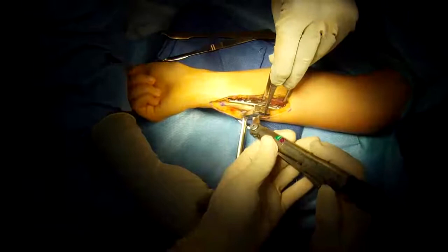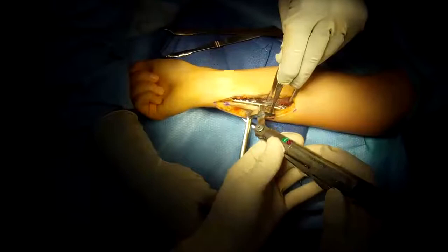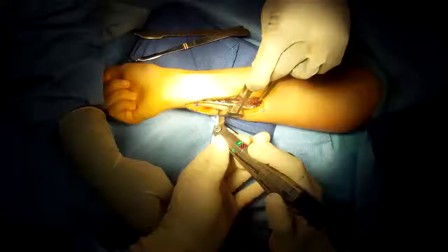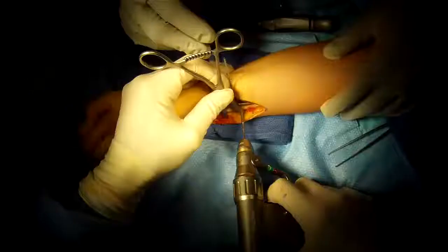This is a special guide that attaches to the plate, through which we can take an exact number of millimeters of bone. Notice how the cut is oblique or angled to increase the surface area for quicker bony healing. This is the second cut.